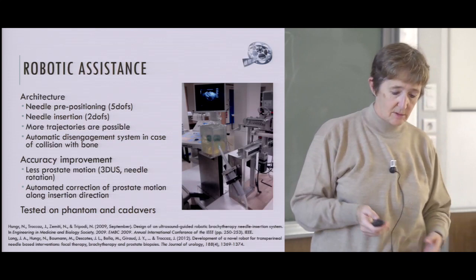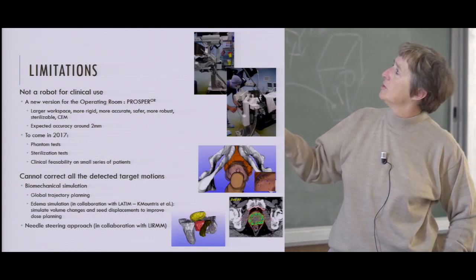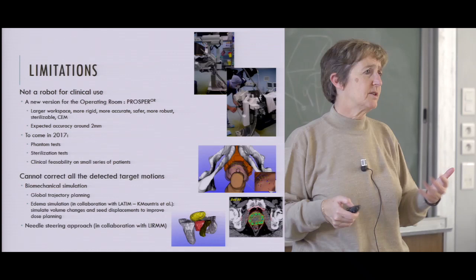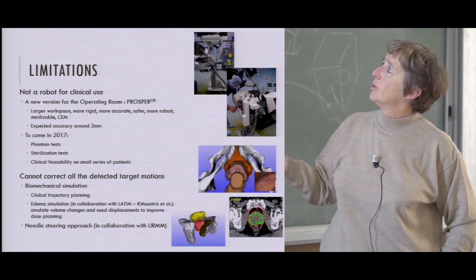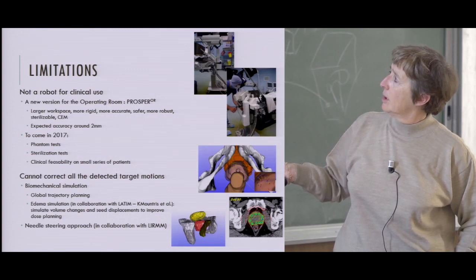So we continued this project, and we developed a version to be used in the operating room. Based on the experiments, we developed another version, which was more rigid, safer, with development standards that can fit the regulations, and where you can detect the risk and so on. And we are in the process of starting a clinical trial on a few patients with this system. We also work with other teams on other subjects.